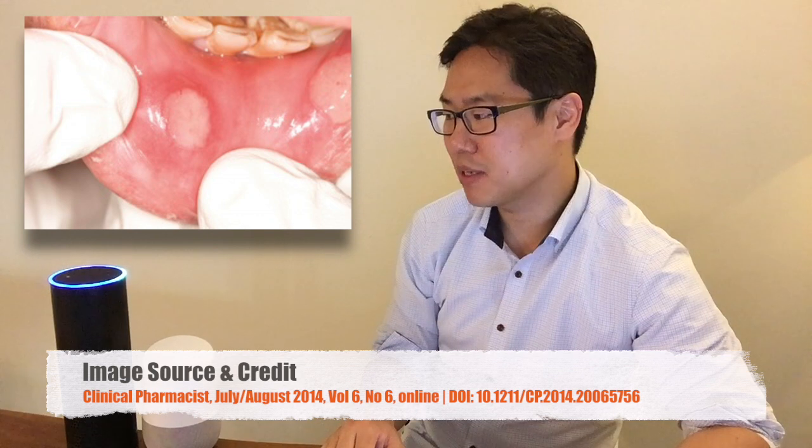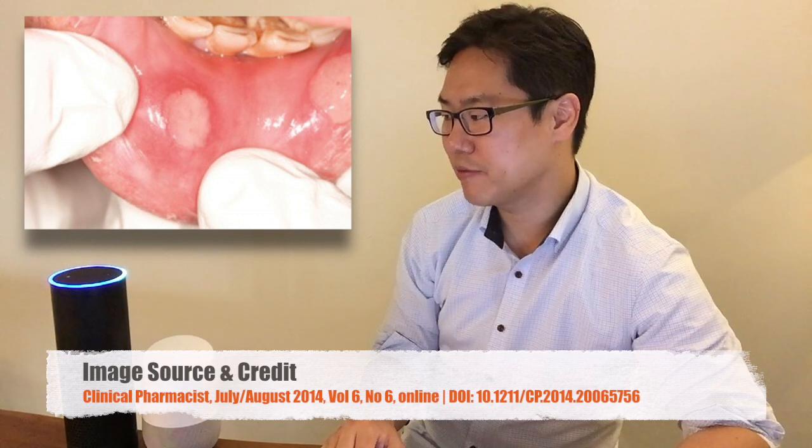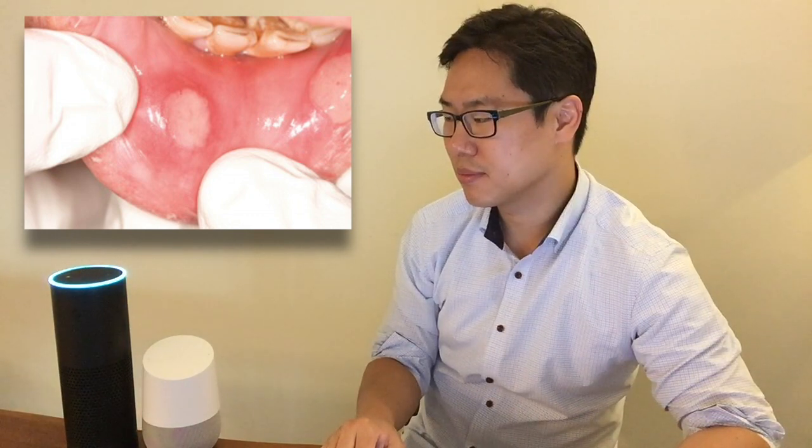Alexa, ask Watson DDS to tell me the most probable differential diagnosis of this lesion. Based on the intraoral digital image you provided, the most probable differential diagnosis is aphthous stomatitis.